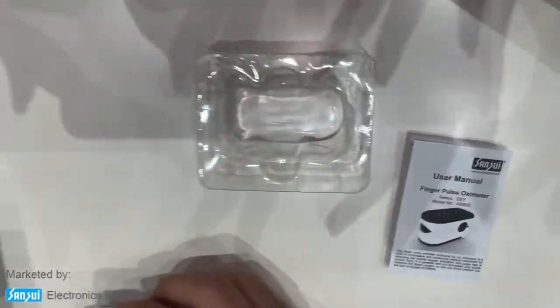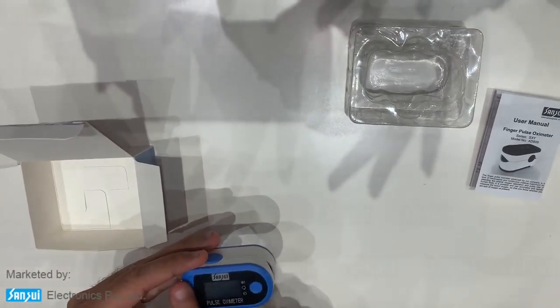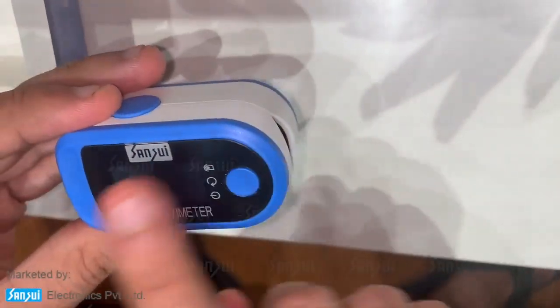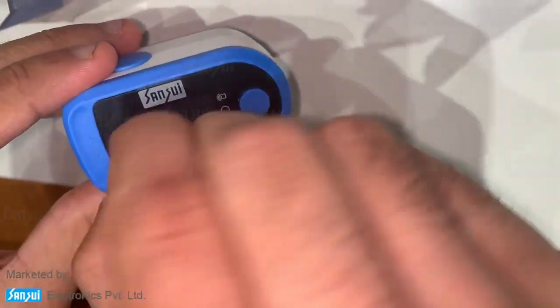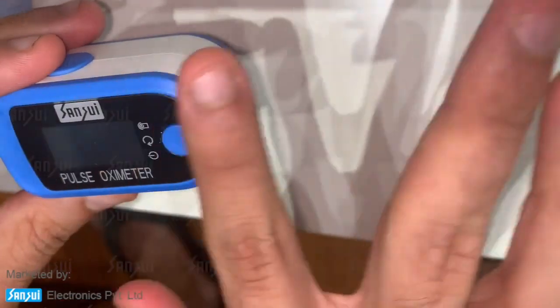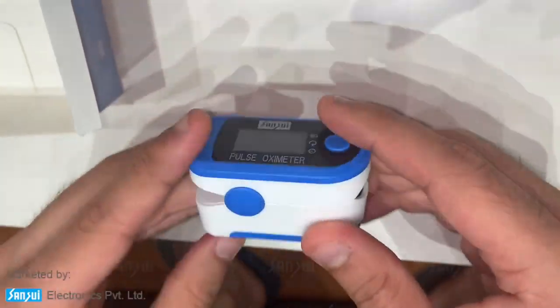Getting to using this oximeter, you'll see that there's a little screen protector on it. When you get it brand new, just peel out the screen and you'll see a fresh screen on the bottom. I'm not going to peel it out at the moment.